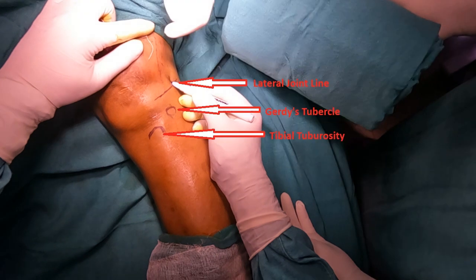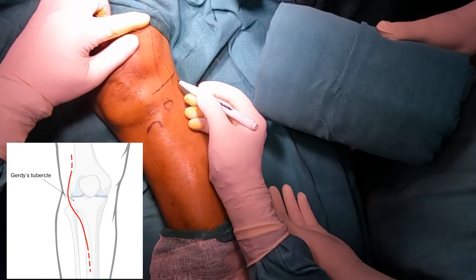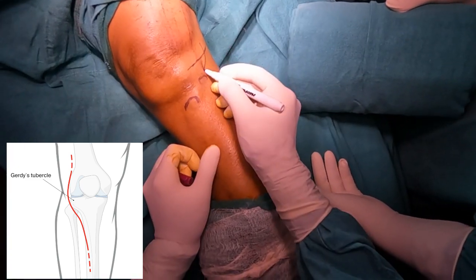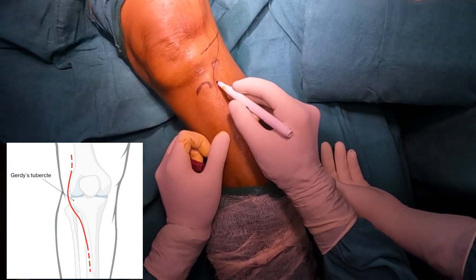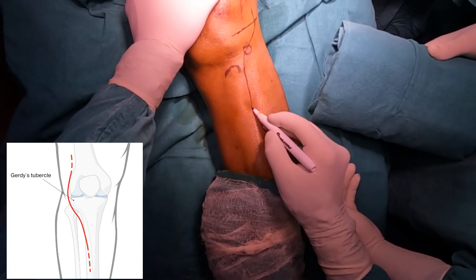The patient is positioned supine with thigh tourniquet inflated. We begin by marking our key anatomical landmarks: the tibial tuberosity, Gerdy's tubercle, and lateral joint line. For a standard anterolateral approach to proximal tibia, the incision runs directly lateral, at and above the joint line, then curves through Gerdy's tubercle and continues longitudinally down, parallel to and 1 cm lateral to the anterior tibial crest.